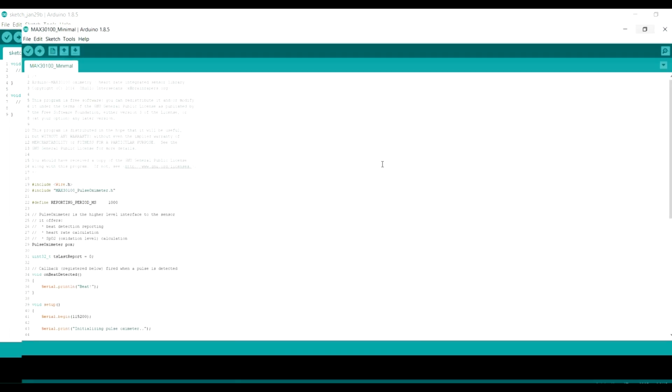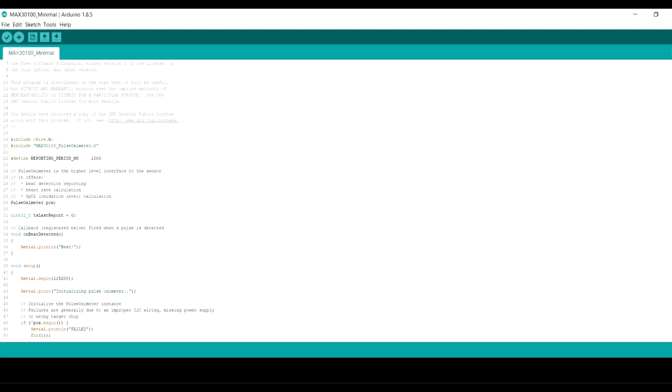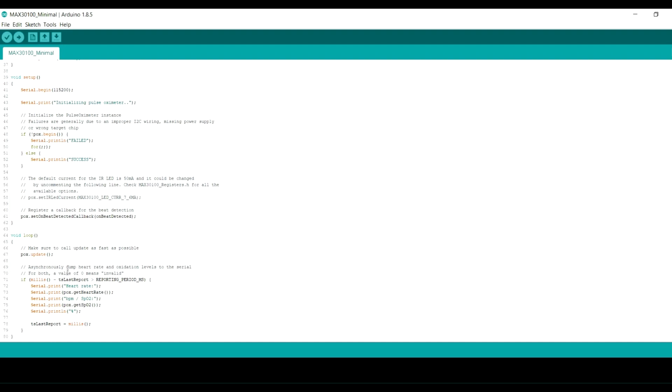And we'll just maximize this. I'm not going to say how this code works, it's not my example. But it basically is going to bring back in the main loop and display a heart rate in BPM. And it's going to display your blood oxygen level as a percentage. So you would upload that to your board. I've already done that. So it's going to my board and we'll power it up.